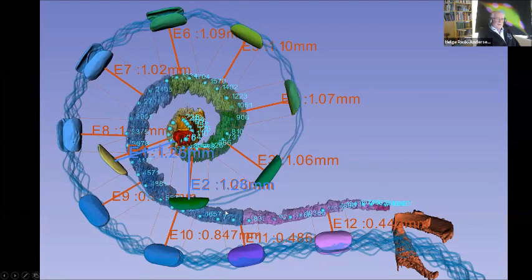And here we can see now the frequency, the tonotopicity, and the frequencies in the human spiral ganglion three-dimensionally. And this was earlier done by Stakhovskaya very nicely from histological sections, but here you get it from the Synchrotron 3D technique. And you can see now, this is a 26 millimeter electrode, it's not so long, and you can see some problems actually with the stimulation.